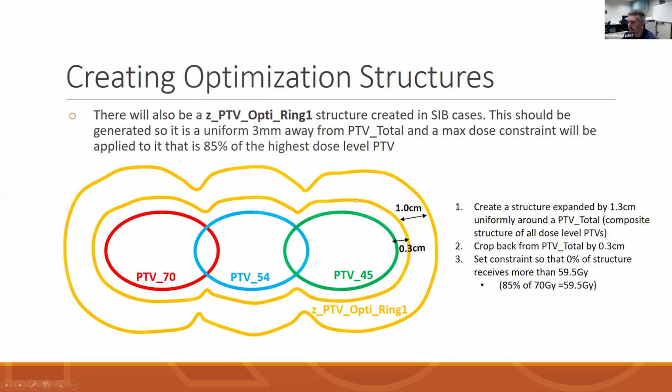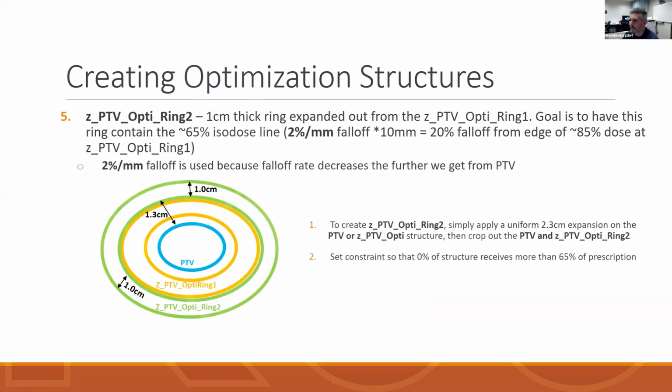So the way that these rings help control the dose fall off and minimize how much dose is going outside of the PTV goes a long way in making a very good plan. So there'll be just a couple more rings that I'll talk about here.